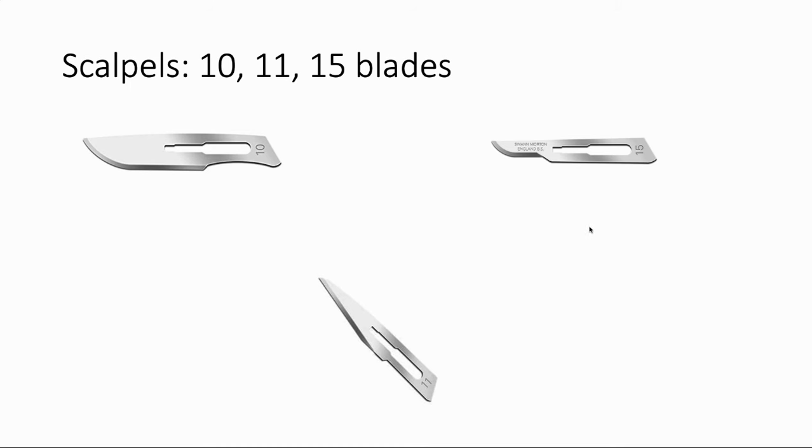Now some scalpels. You all did anatomy in your first two years, but there are numbers for these blades, and there are really only three we commonly use. The jack-of-all-trades blade is the 10 blade — relatively large. A 15 blade is just a 10 blade in a very small version. And if you see a blade that looks like a very pointy end, that's probably an 11 blade — better for something like stabbing an abscess rather than making a long sweeping cut.